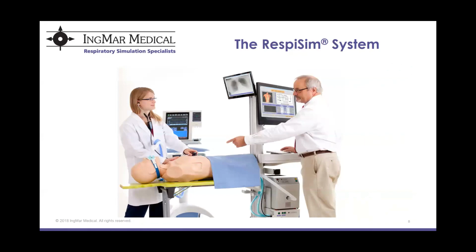The Pro package comes with our mannequin. And you can see here that the mannequin is intubated. So I have a red spotlight now. This mannequin is intubated and the ventilator is connected to the ET tube. So the student is doing the most realistic thing with a mannequin that they can. They are intubating the patient and placing them on a ventilator.